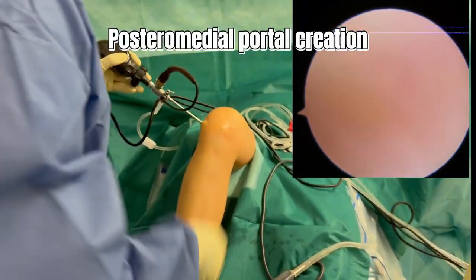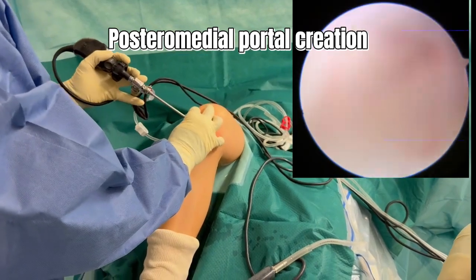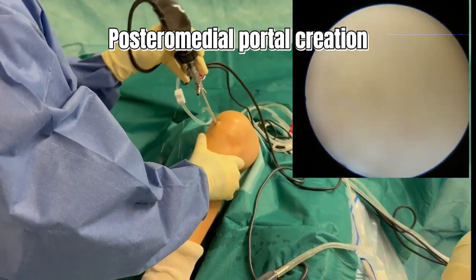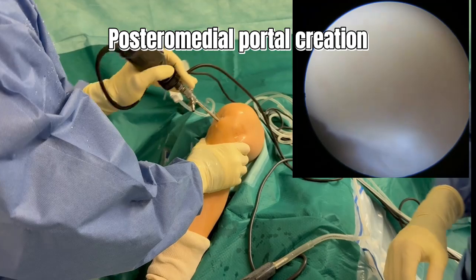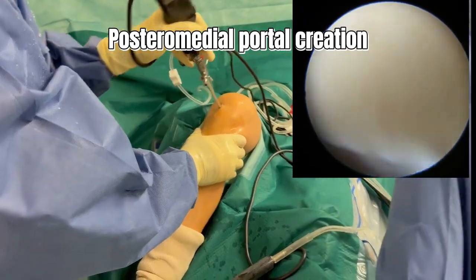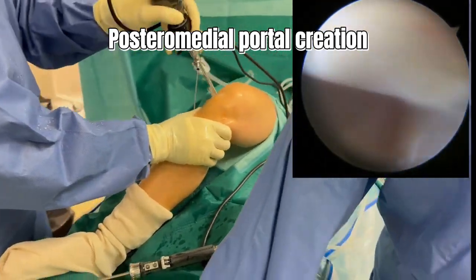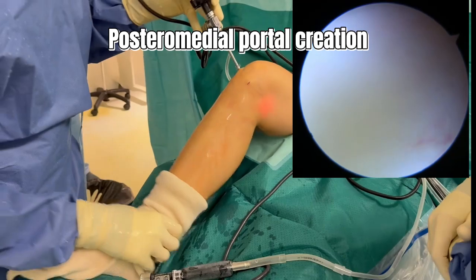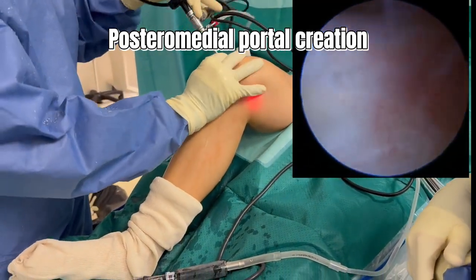With the knee maintained at 90 degrees of flexion, the arthroscope introduced through the anterolateral portal is guided posteriorly between the PCL and the medial femoral condyle to access the posteromedial recess and visualize the meniscal ramp.